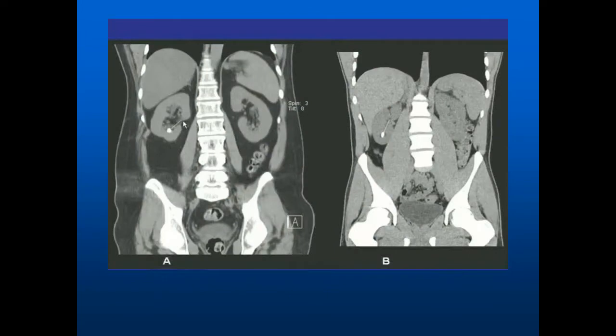This is called a CT scan or a CAT scan. And this is a radiograph that's really a good picture, and is particularly good for taking pictures of stones. And so we know in this case where the problem is located, and that's the beginning of the solution.